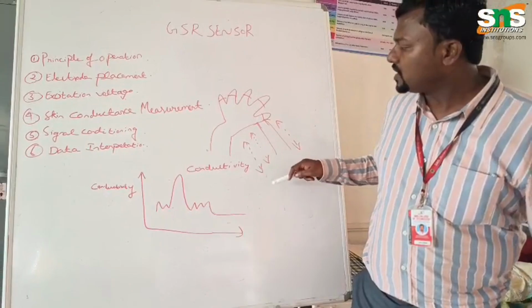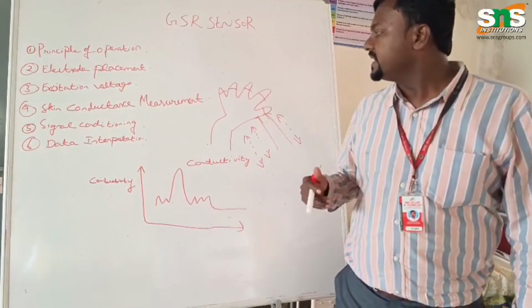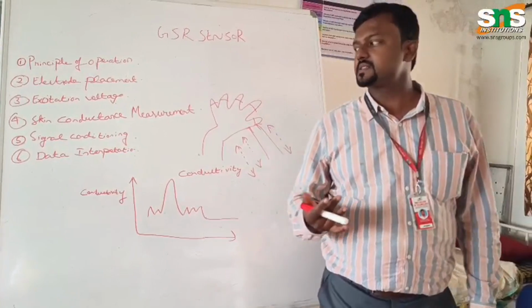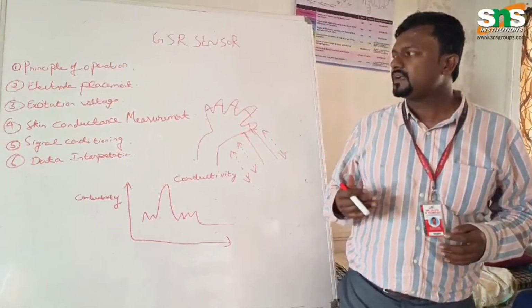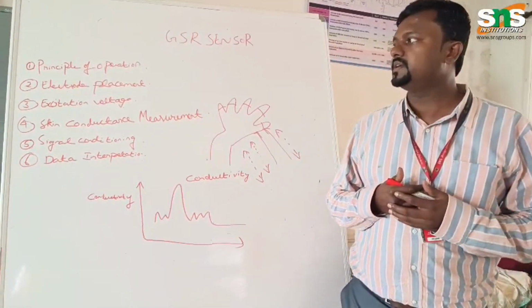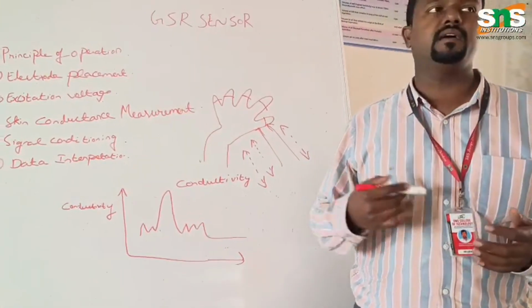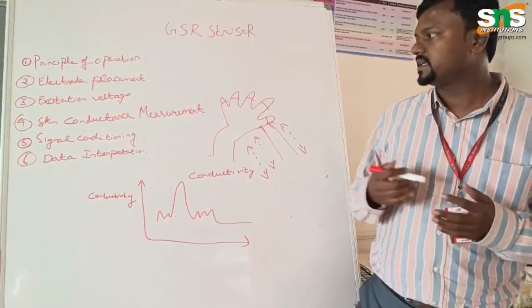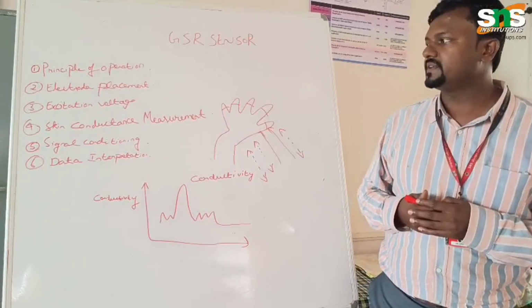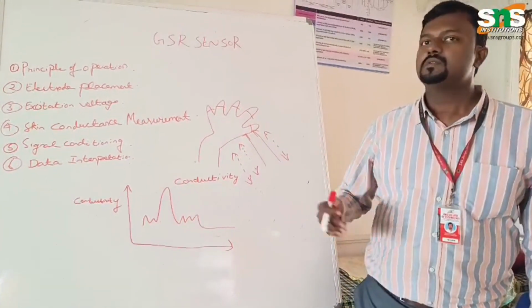On these fingers, normally we apply some gel and place the electrodes. Immediately the signal from the fingers passes through. We apply a very minute excitation voltage of a small DC level to compare the level between the human body and our threshold level from the external instrument. Based on the comparison of the two different voltage levels, the conductance measurement can be easily done.